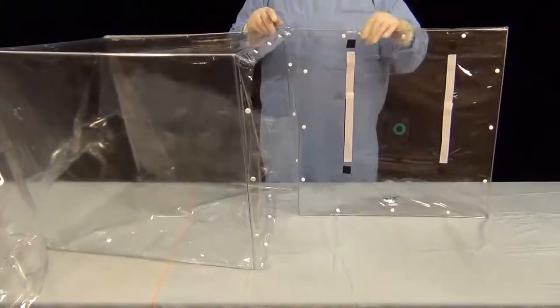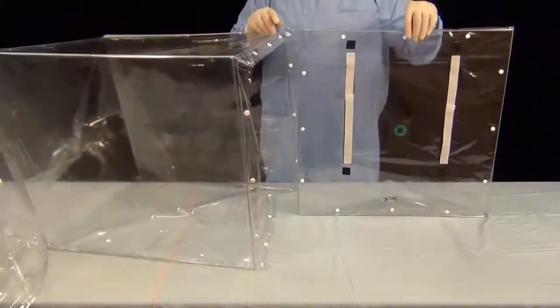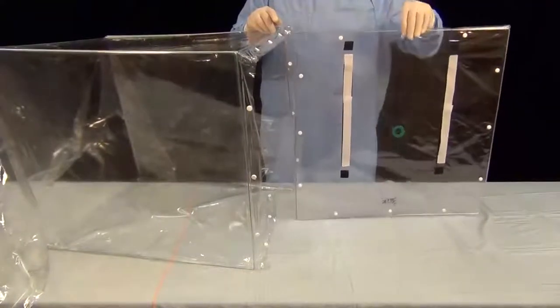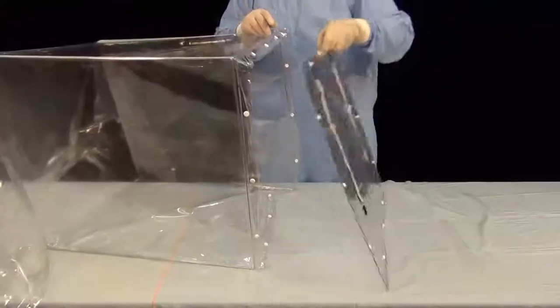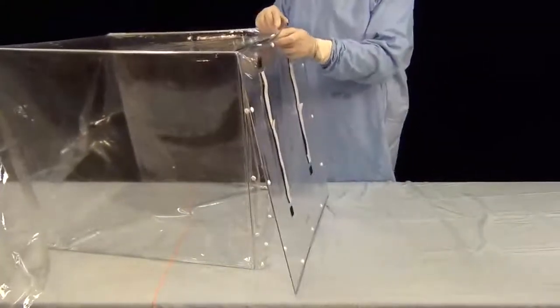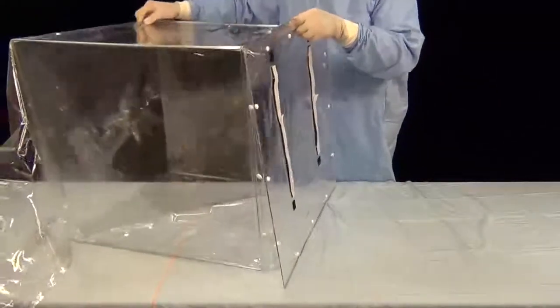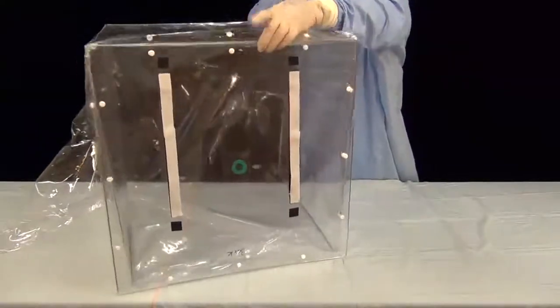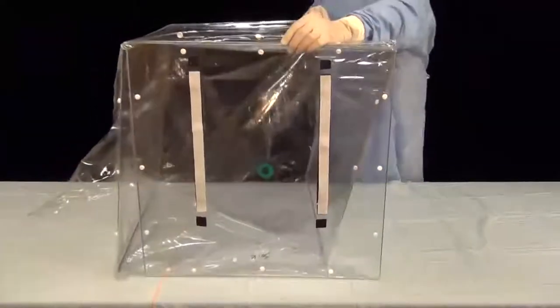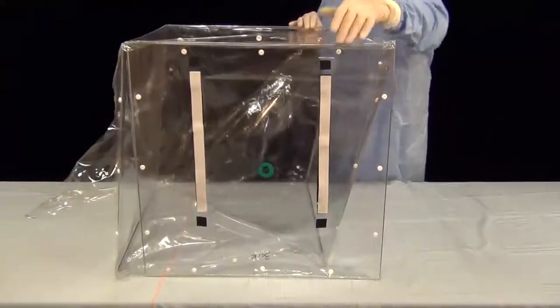How long does it take to do it? Not very long. And you'll see within this back wall, we have the access ports already in place. So let's continue now. To do this, we're going to realign the tent so that it will be quite clear to you.